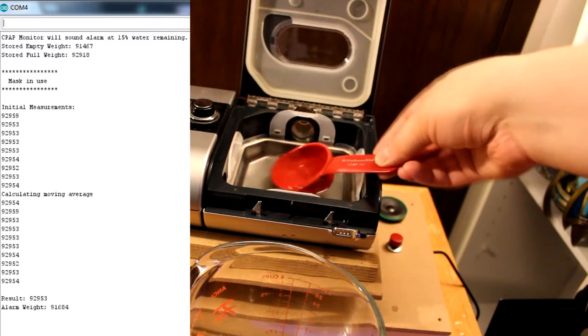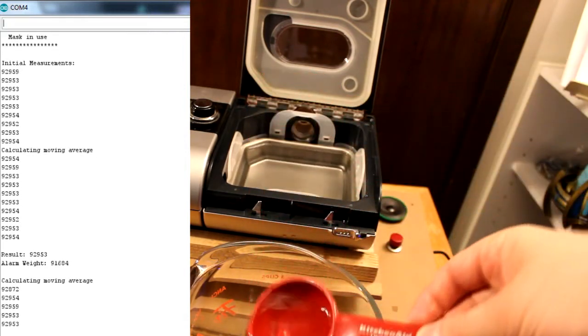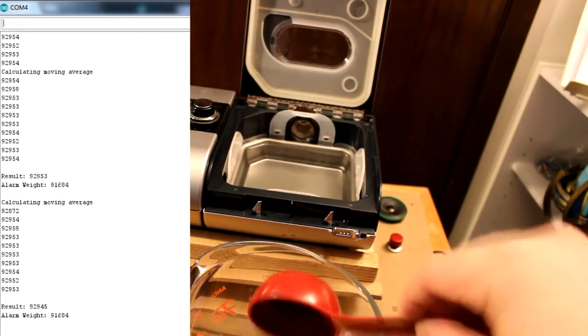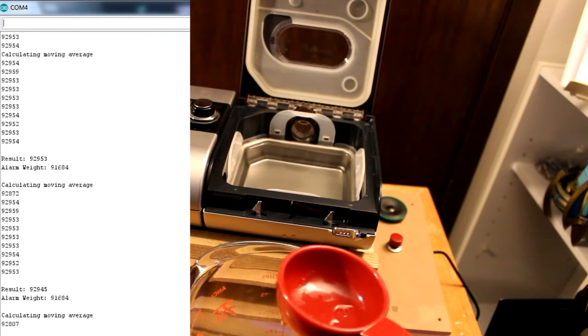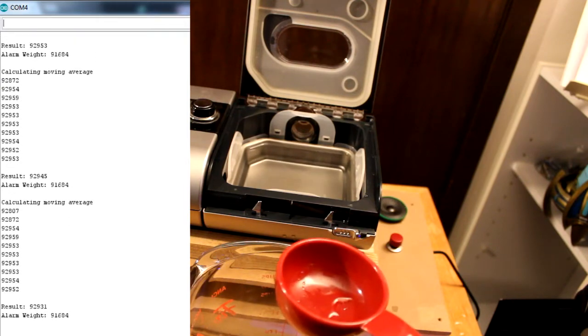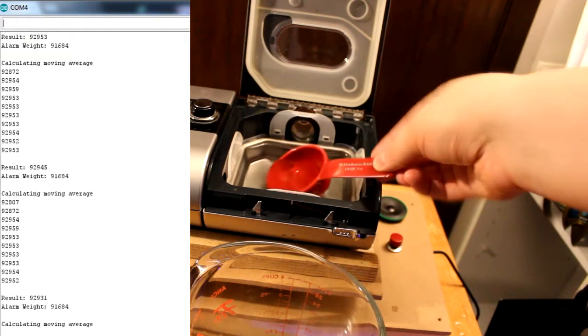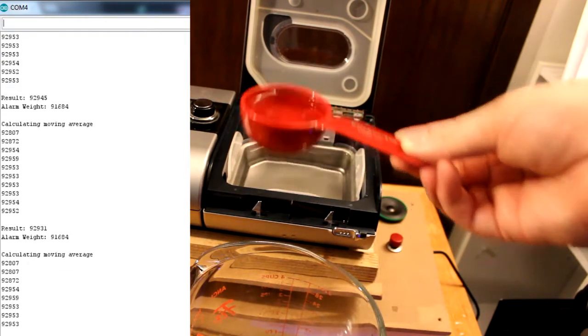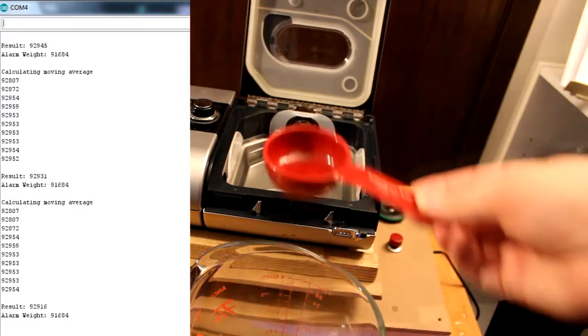Each new measurement is added to the moving average, and this value is compared to the alarm weight value. As water is removed from the reservoir, the moving average slowly decreases with each new value moving into the array, pushing out the oldest value.